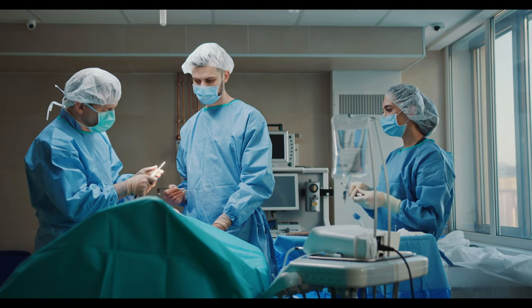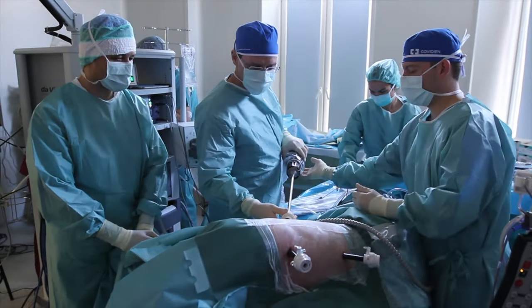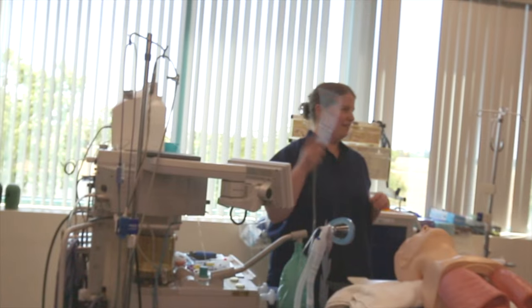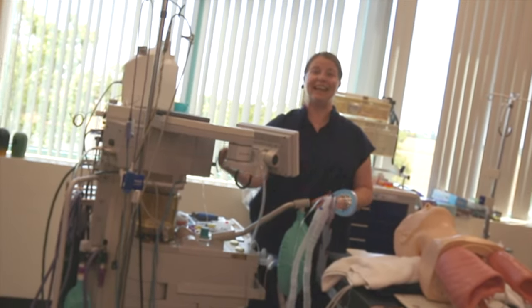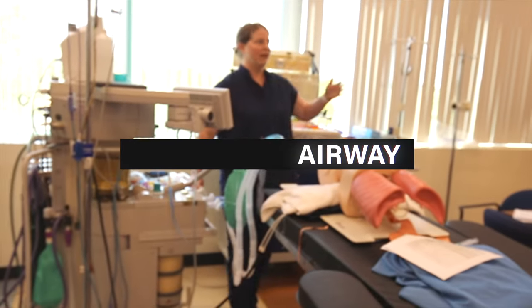Okay, so there's suction and then we have our Ambu bag. Emphasis on suction, this is the S of SAMMTIDE. So y'all really get it, suction is important. A is for airway.